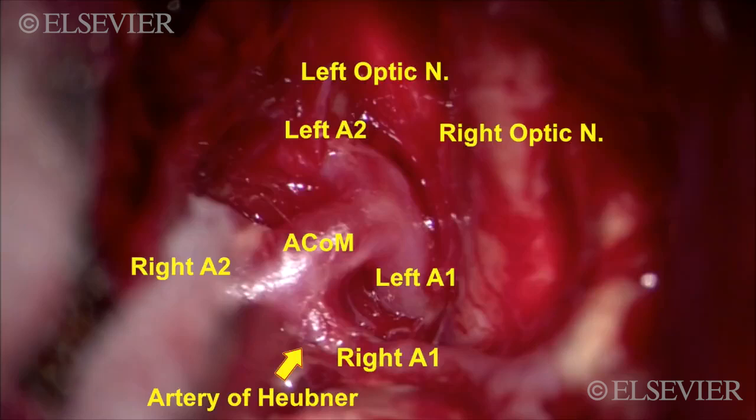This is a view from the right-sided approach that demonstrates both the right and left A1 segments, the bilateral A2 segments, and the rotated Acomm complex. The optic apparatus can be seen for reference too.